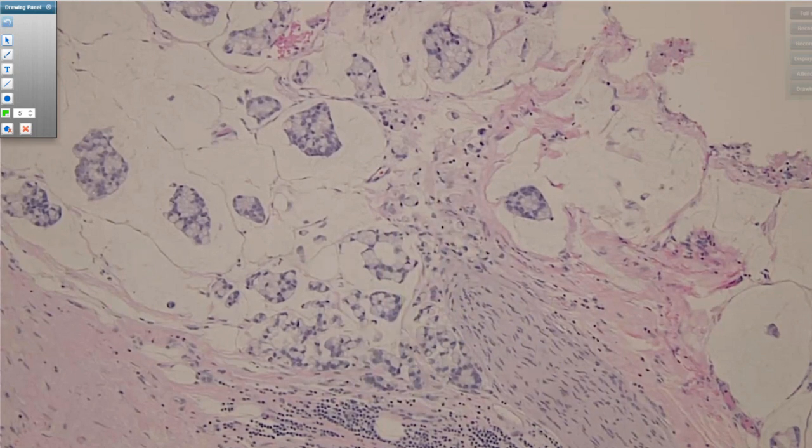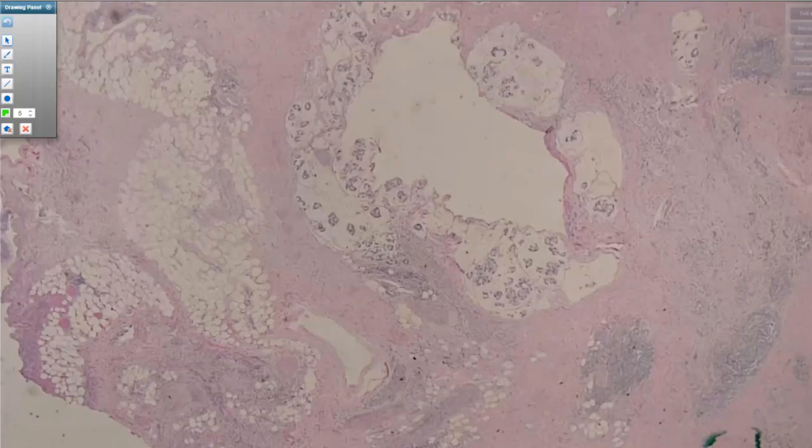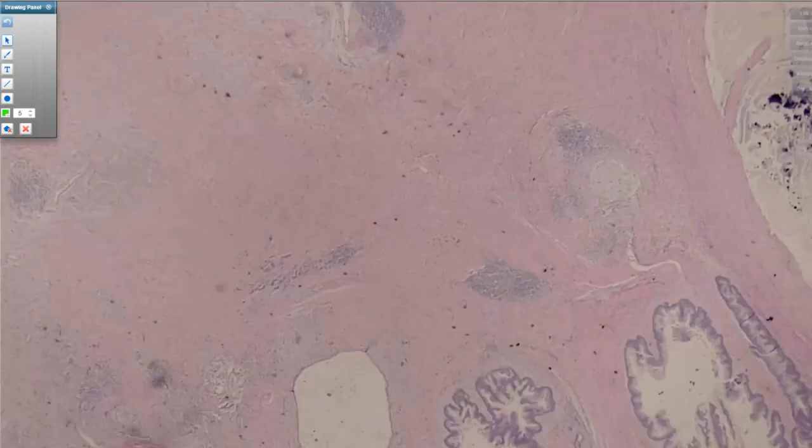You have small groups of small glands, individual cells, you have an infiltrative growth pattern, you have neoplastic cells floating in mucin, and you have all those things associated with nerves. And so any one of those would have been enough, but in this case, we happen to get all three.